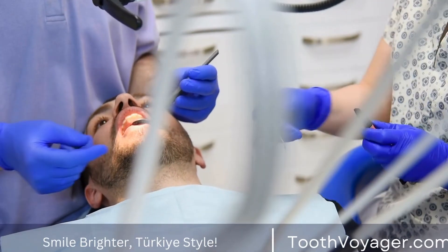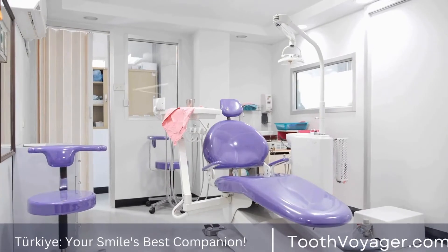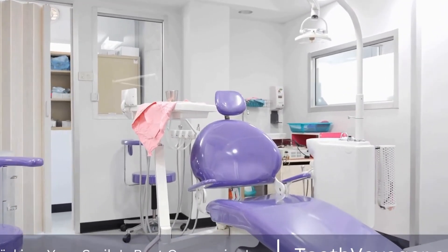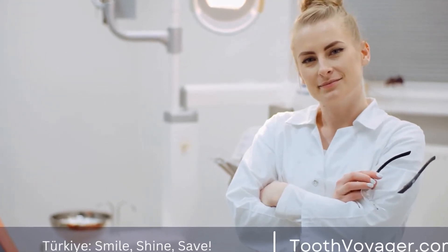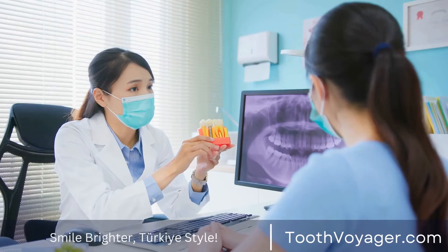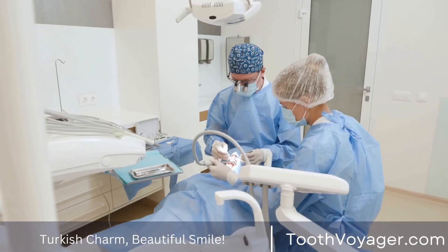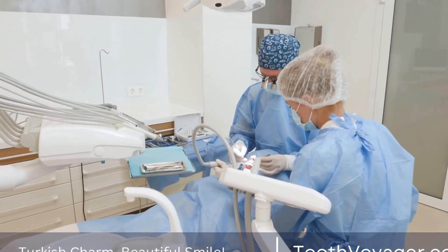From concept to smile, the creation of dental veneers. Dental veneers are a popular cosmetic dentistry option for those looking to improve the appearance of their smile. These thin shells of porcelain or composite resin are custom made to fit over the front surface of teeth, covering imperfections such as discoloration, chips, or gaps. In this video, we will take a closer look at the process of creating dental veneers from concept to smile.